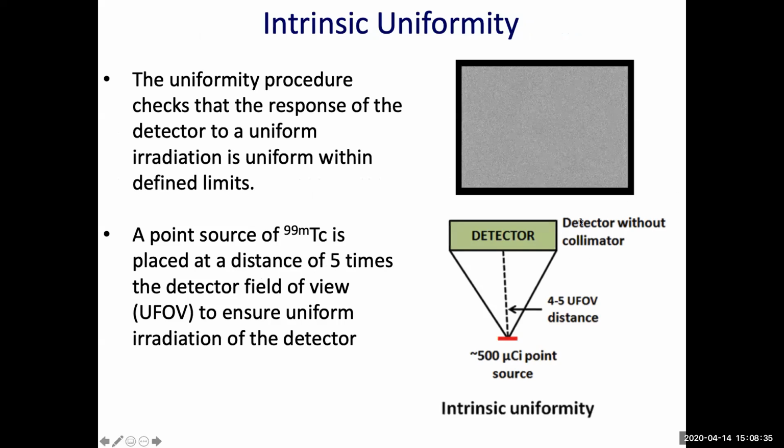So interpretation, as physician, interpretation of clinical images taken with the gamma camera rely on the assumption that differences seen are due to the differences in the tracer distribution in the patient only, and not differences introduced by the system. We don't want to see any lesion because of a system artifact or a crystal crack. Any changes in the distribution should reflect the distribution inside the body.